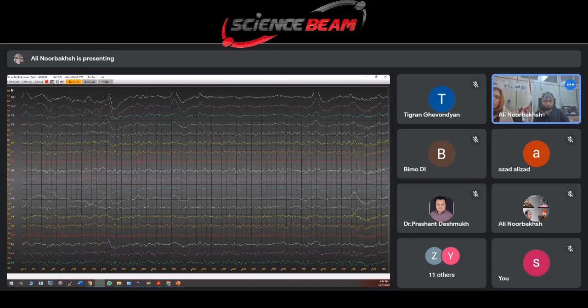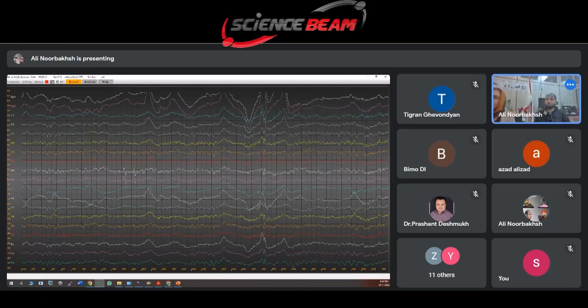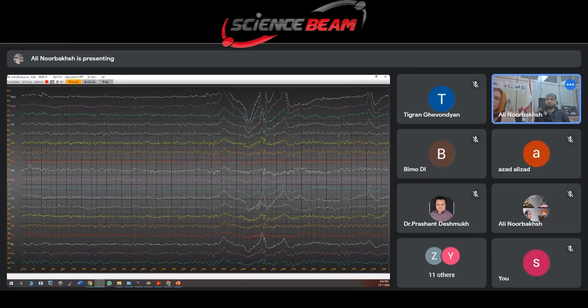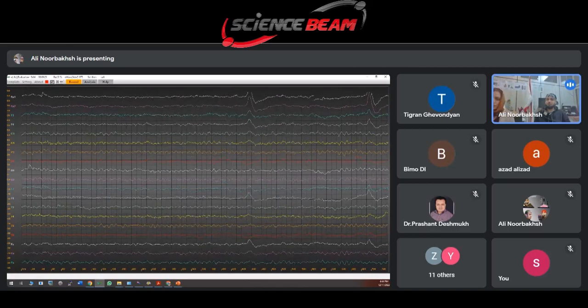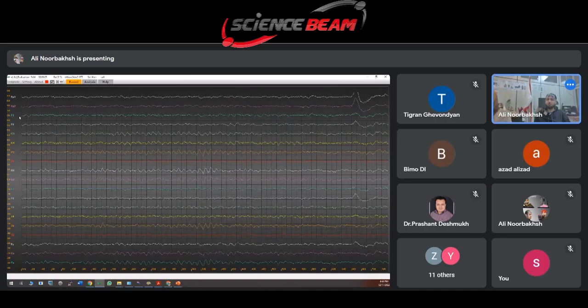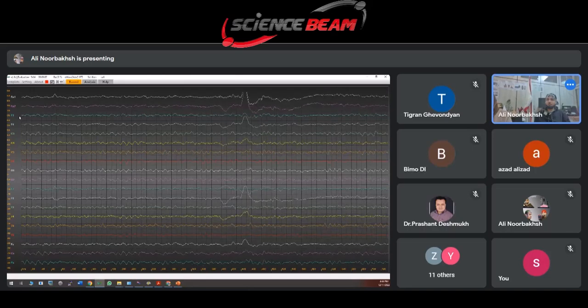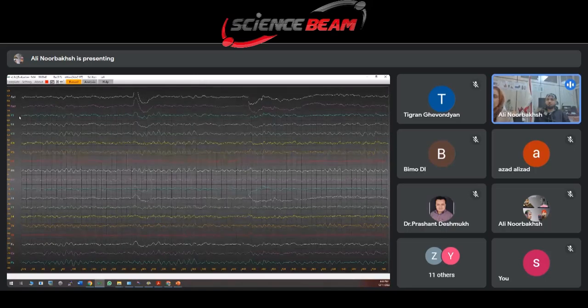Please see. I open. Yes, this is I open. We should record for 4 minutes. You can see eye movement on F7 and F8.